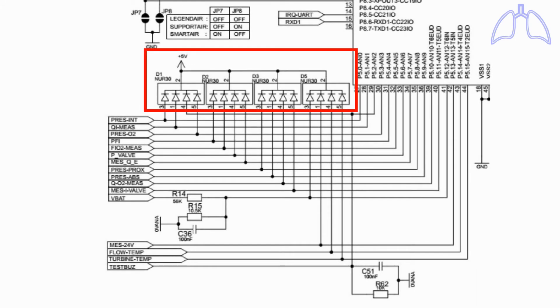Each analog input pin of port 5 is connected to the anode of a low forward voltage high-speed diode. All cathodes of these diodes are connected to positive 5 volts, to prevent the analog inputs from exceeding positive 5 volts.